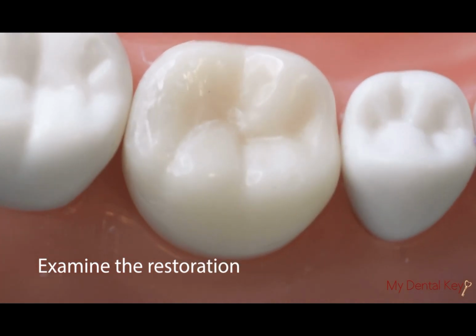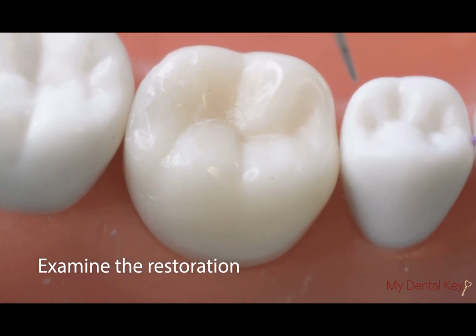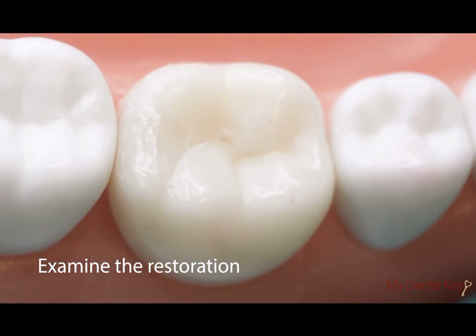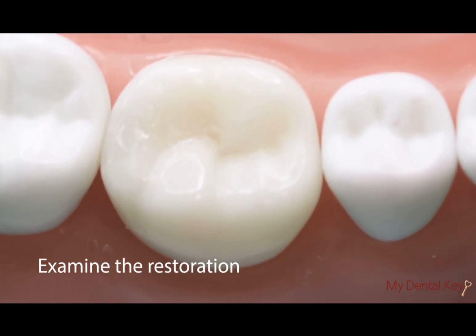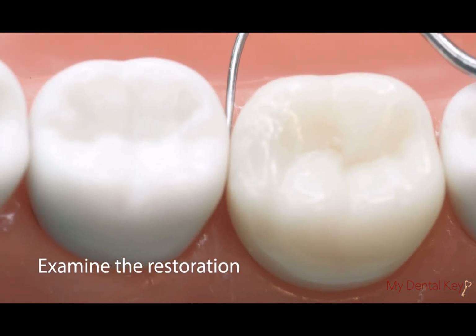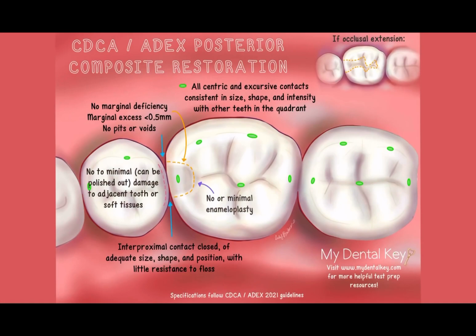Ensure that the composite is flush to the cavosurface margin, that the marginal ridge is the correct height, that there is a closed interproximal contact and correct interproximal contour, and that there is no overhang. There should be minimal to no enamelplasty, no damage to the adjacent tooth, and no damage to the soft tissue. Use the My Dental Key checklist in order to check your work.